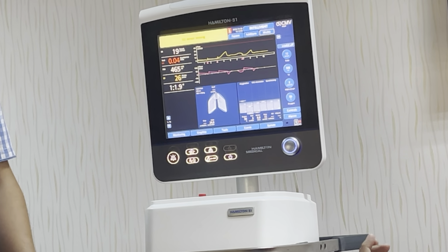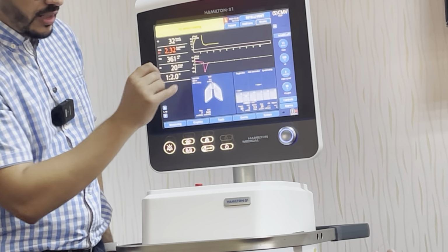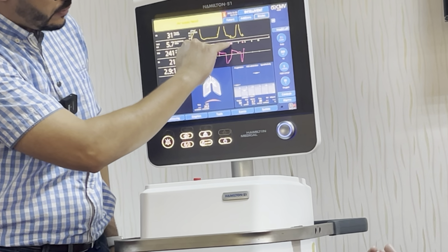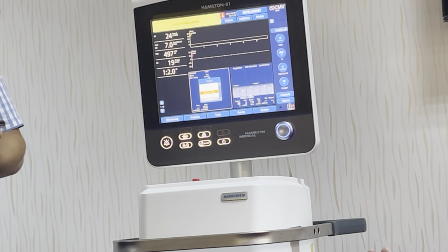Now, how can we know that the patient is taking a spontaneous breath? With two indicators. We have this small indicator, this one. Or you will see the diaphragm here. If you see the diaphragm, this means the patient is taking a spontaneous breath.